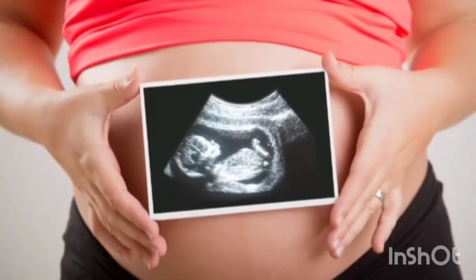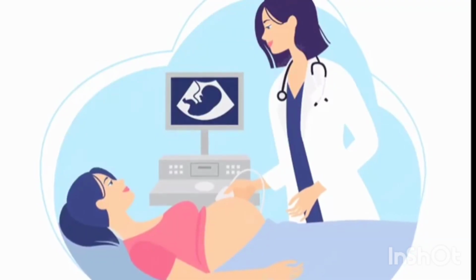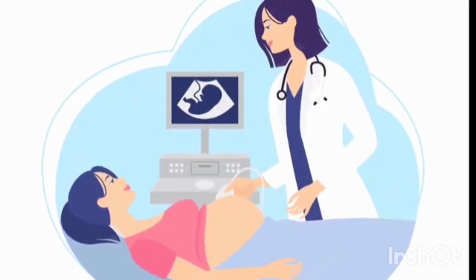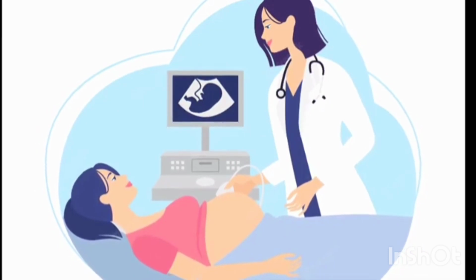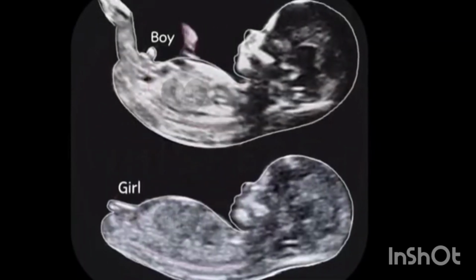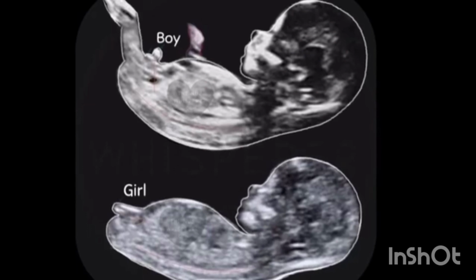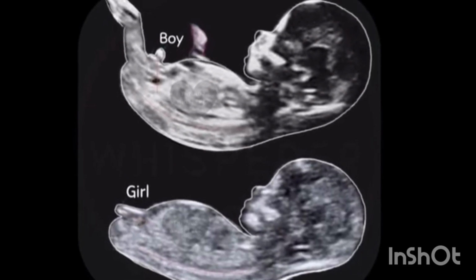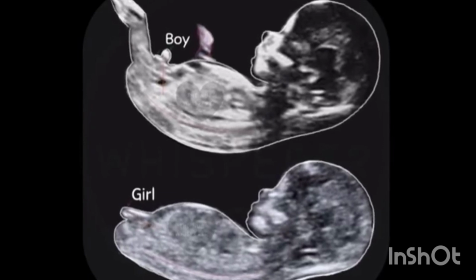Between weeks 18 and 20, a trained sonographer will perform a detailed anatomy scan called a level 2 ultrasound. By this stage of fetal development, you should be able to find out the sex of your baby. While telling the difference can sometimes be tricky, there are a few things the sonographer will look for to make the determination. We can be 95% accurate at this early stage of pregnancy.